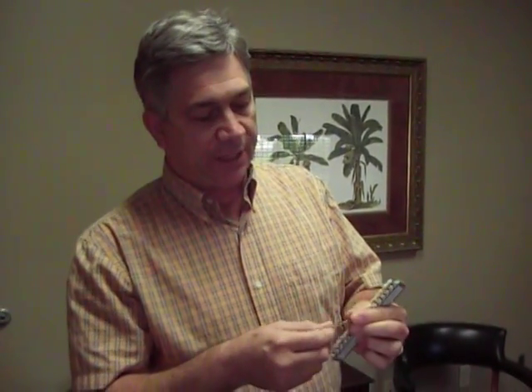And then you just pull out that tab, and then you just photograph each tab. Once you've figured out all the colors that are in that tooth, you photograph each of those tabs by themselves. And that will help you get your shades a lot closer, rather than picking up an old shade tab that's got multiple colors in it.